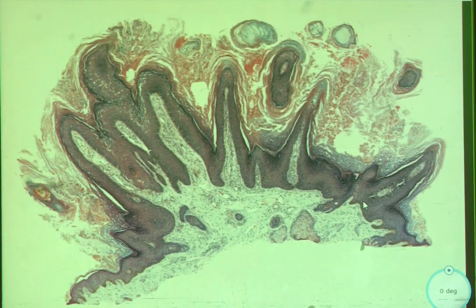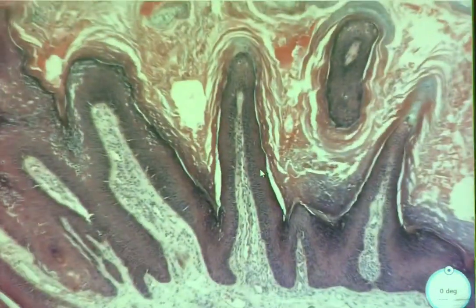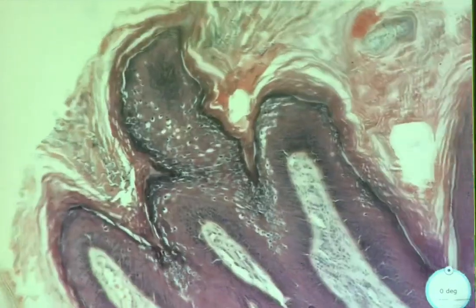So this is an exophytic lesion. Looks like it's kind of being pulled up. It's kind of acanthotic. There's hyperkeratosis. Kind of looks like it's pinching in down at the base, sort of. Here, which is a sign that you're doing the verruca thing. You can look into the individual cells.